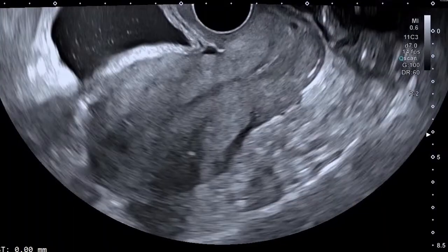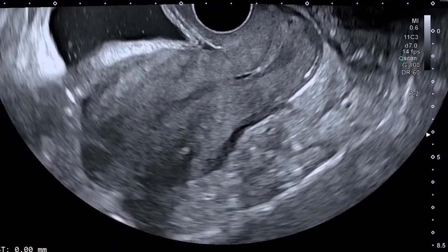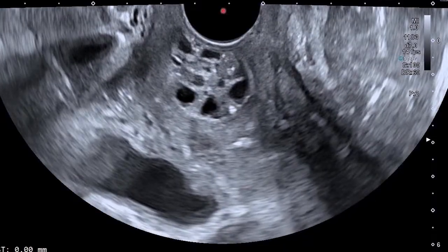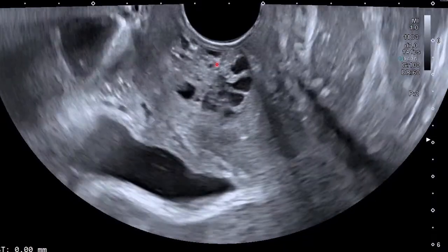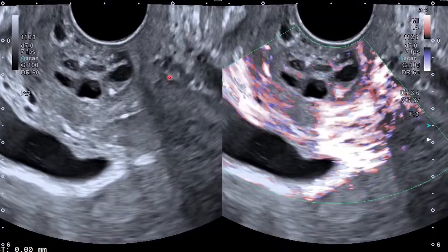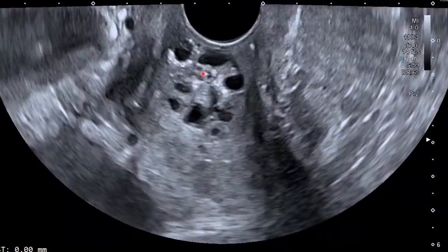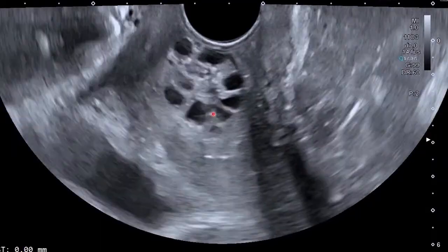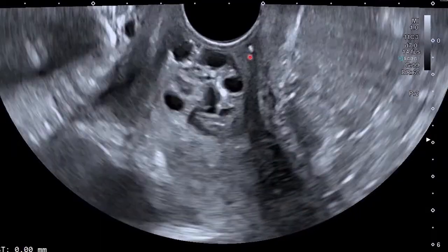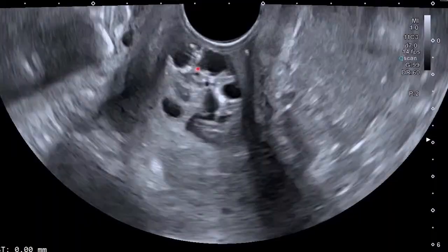So give me your suggestions. I also need a pool of differentials. What can this be? Initially, I thought it is bowel, but there's no bowel motion, as you can see. The fluid is the only one that is moving a bit. So, what's your take on this?